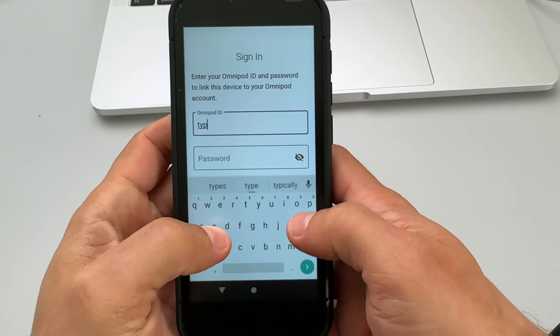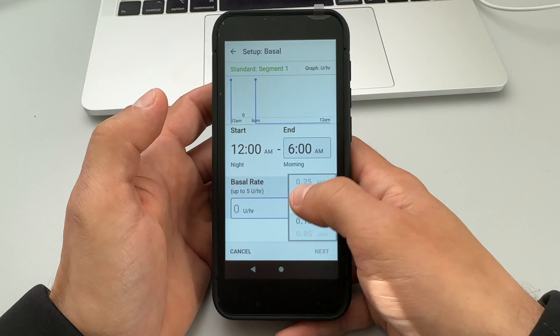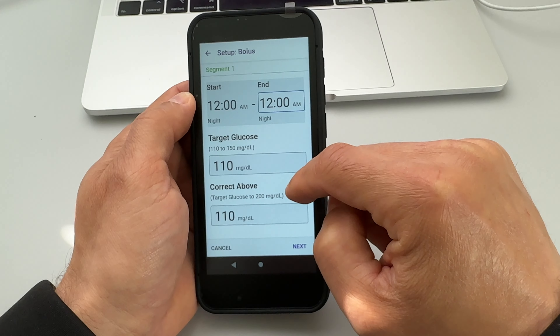In the box I found a quick start guide, a brand new controller (aka PDM device), and 11 Omnipod 5 pod units. You can wear each pod for 72 hours, so the starter kit should provide enough pump supplies for about a month. There is also a plastic cover for your controller, a USB charger, and a few pieces of overtape.